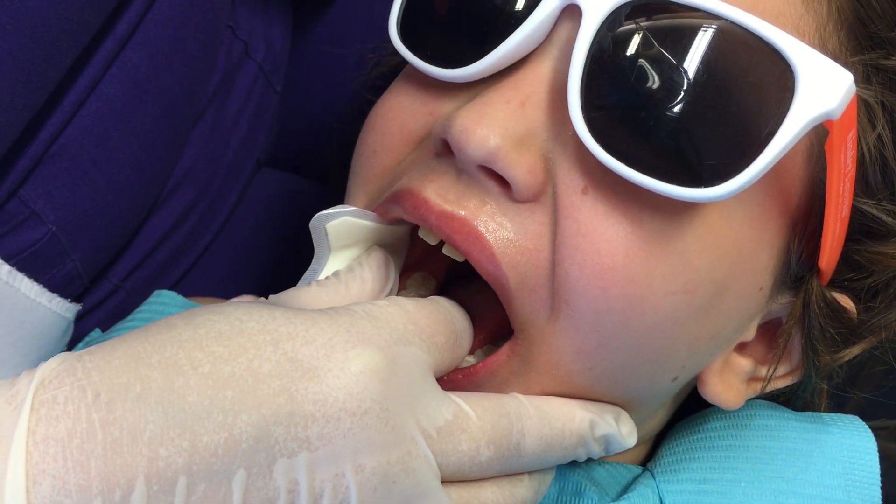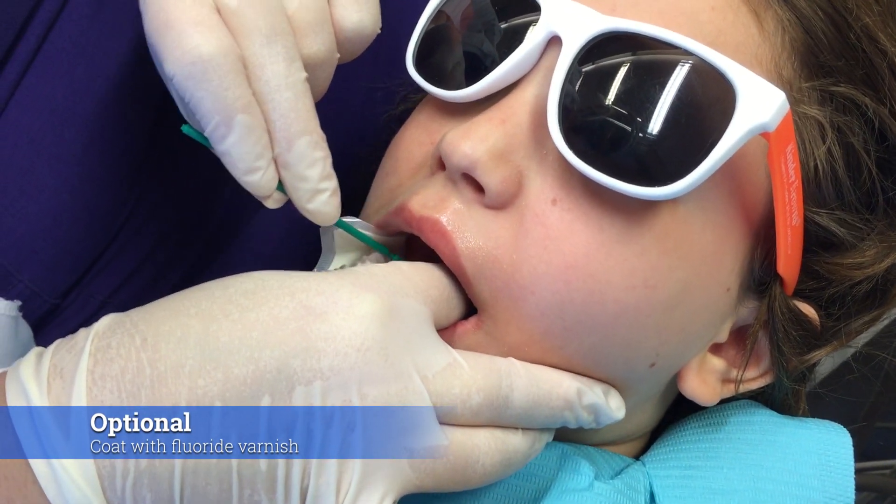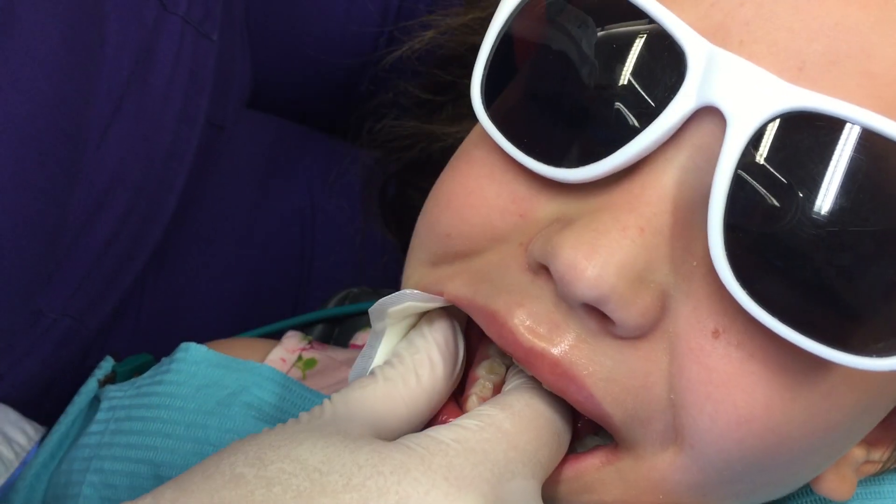This is optional — it's not necessary for efficacy, it's just my personal preference. I do like to cover with a varnish. So this is Floromax mint — we like to call it candy cane.